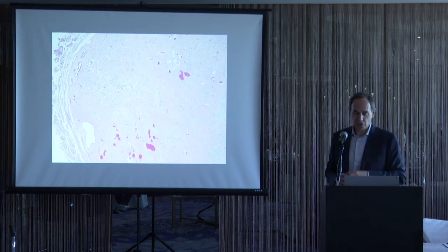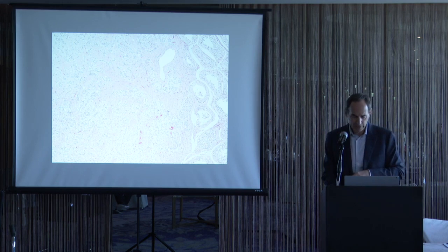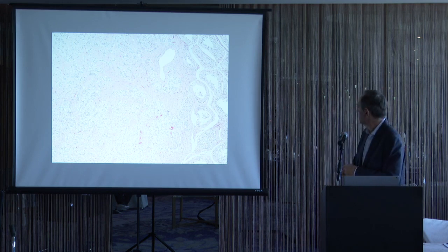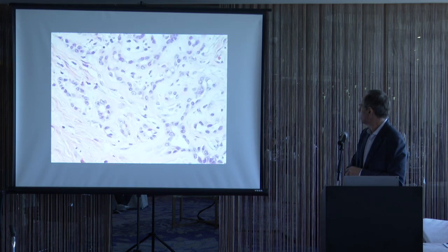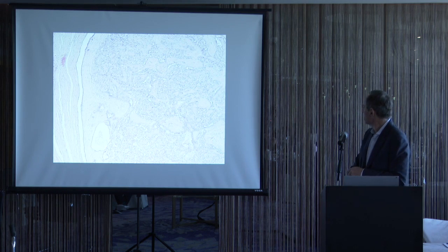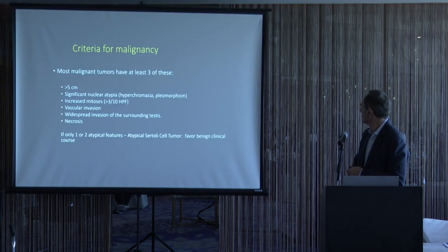In contrast, this is a Sertoli cell tumor. And Sertoli cell tumors typically have a very bright pink collagen matrix. And then, by definition, most Sertoli tumors will have some tubular differentiation as well. Here we see these little nests of cells with this dense collagen. And classically, Sertoli cell tumors will have that just central nucleolus, just like normal Sertoli cells. And here we see them forming tubules. Another example of Sertoli cell tumor, forming little cords of cells as well.